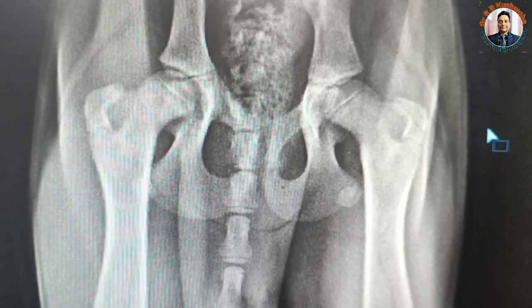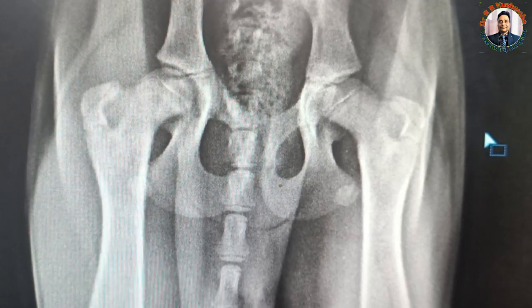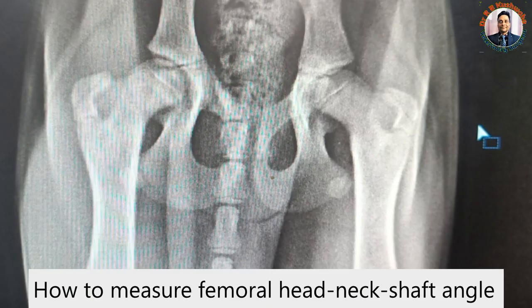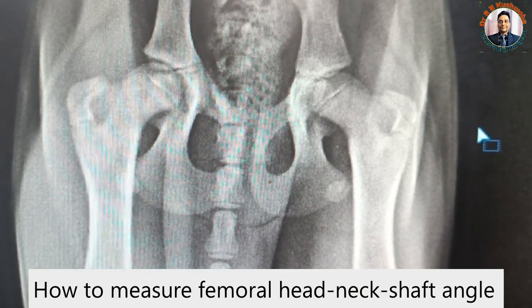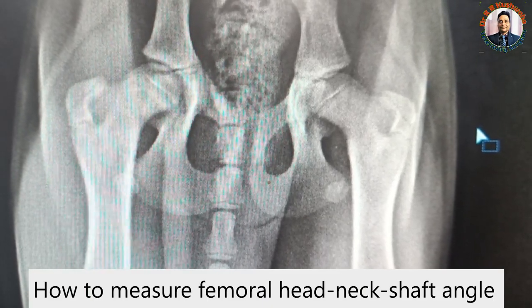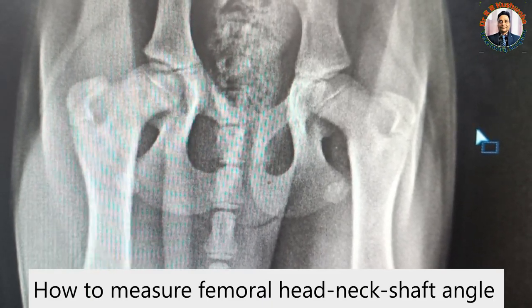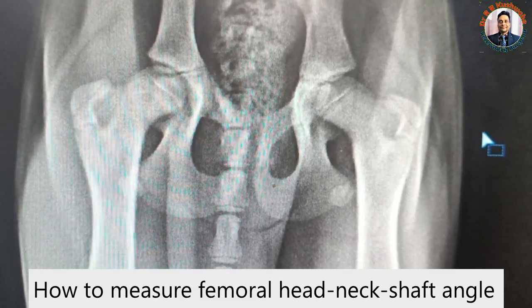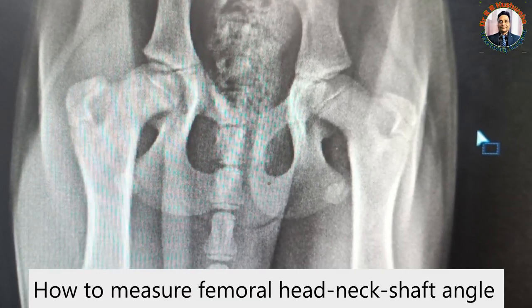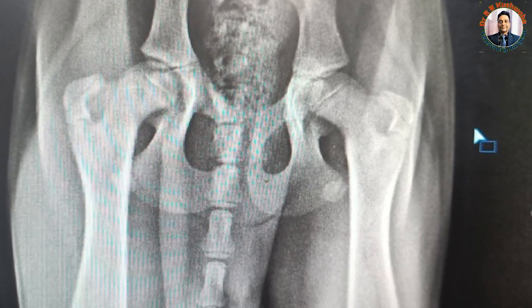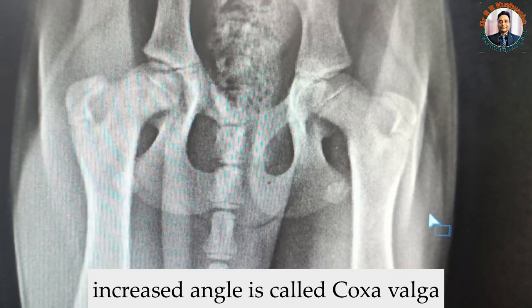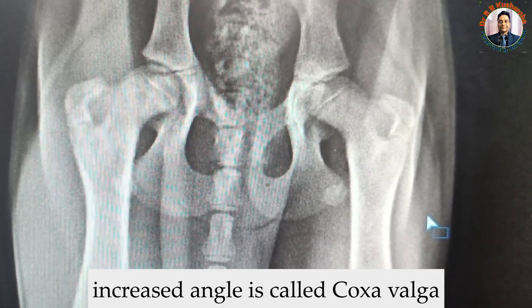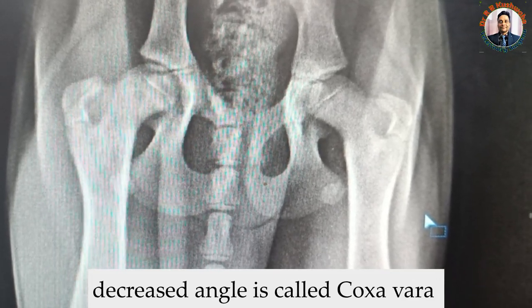Today I am going to demonstrate how to calculate the femoral head neck shaft angle. In the case of hip dysplasia, this angle is very important, because by measuring this angle we can say whether there is a coxa valga or coxa vara. When there is an increased angle, we say coxa valga; if there is a decreased angle, we say coxa vara.